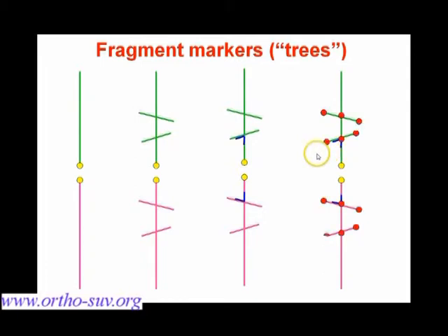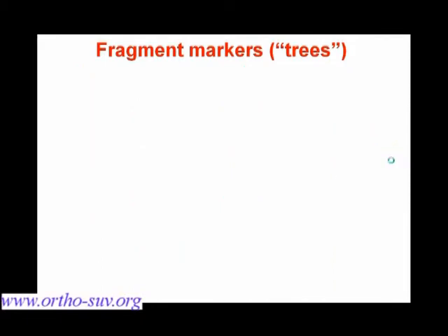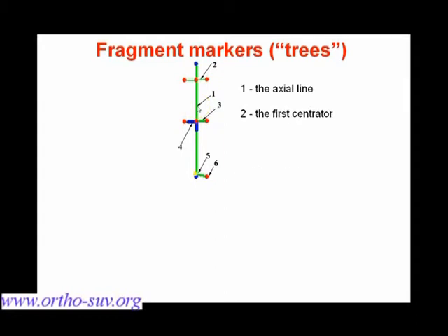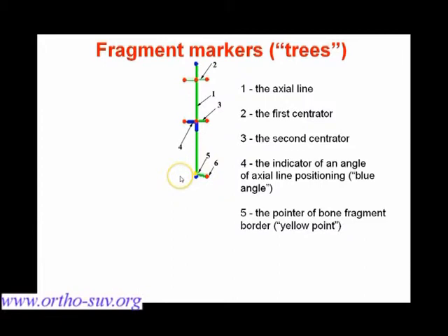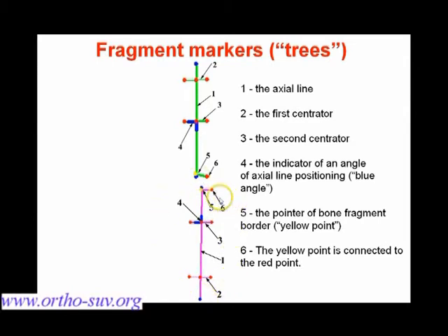We will speak about the blue angles a little later. Each tree has six red points placed in the horizontal lines and in the middle of these lines — they are used to find the center of bone fragments. Each tree also has one red ball at the end of the line connecting with the yellow point. So, to summarize: each tree has an axial line, a first centrator, a second centrator with a blue angle, a yellow point marking the fragment border, and a red point connected to the yellow point by a horizontal line.